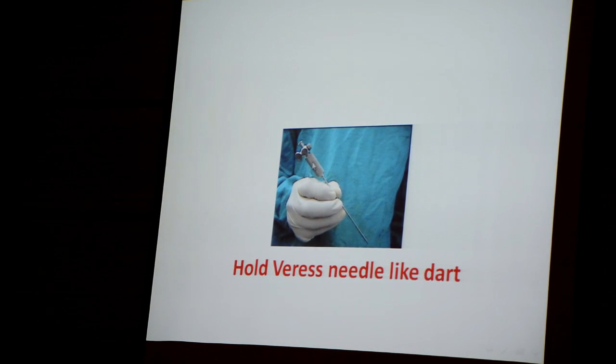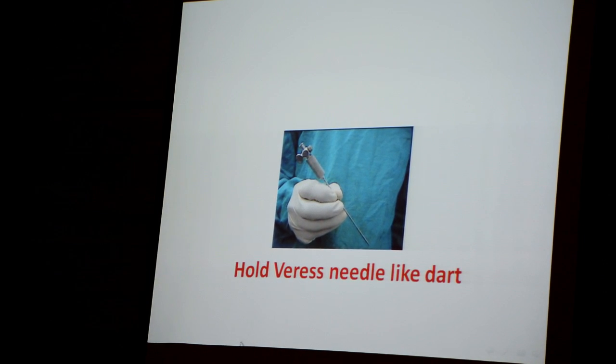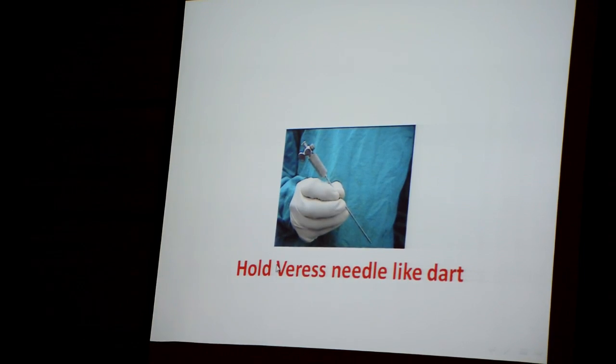How to hold the Veress needle? We are talking about it in Najaf. Like taking it like this.